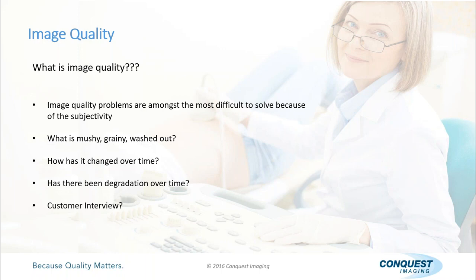And if you're talking about a lot of your accreditations, American College of Radiology, there's some cardiac accreditations, one of the primary things that they have you do is do the exact same test every 6 months, every year, so you can then go back and look at the previous year and say, is there degradation over time? So it's really important that you evaluate that and have a tool to evaluate it.